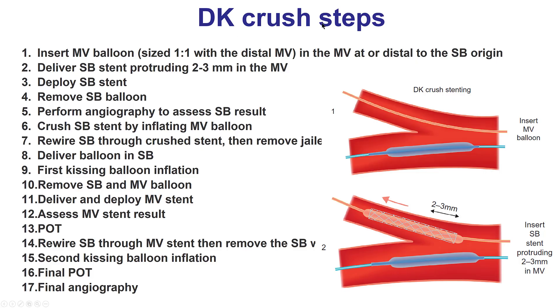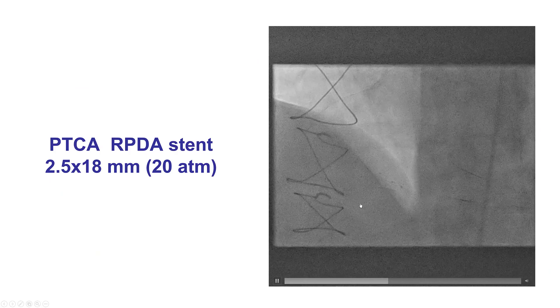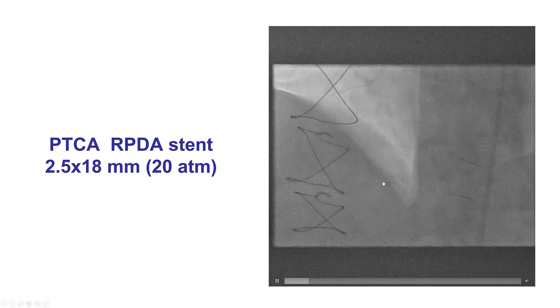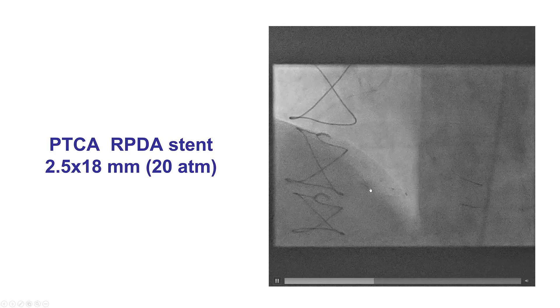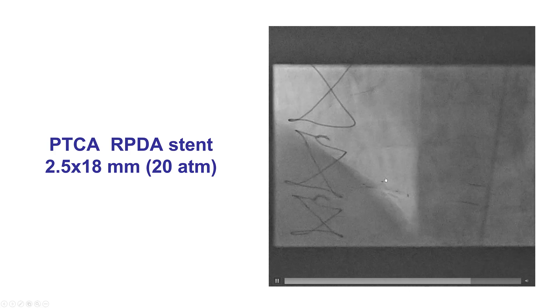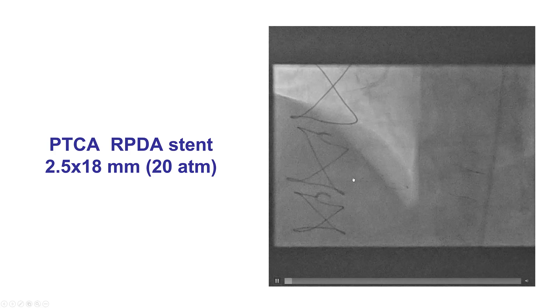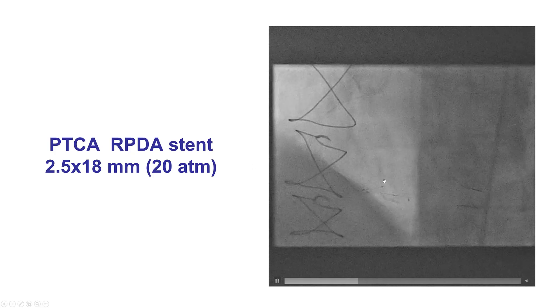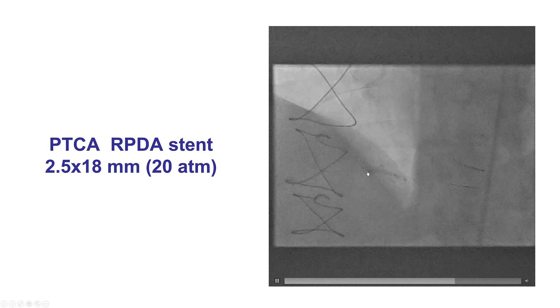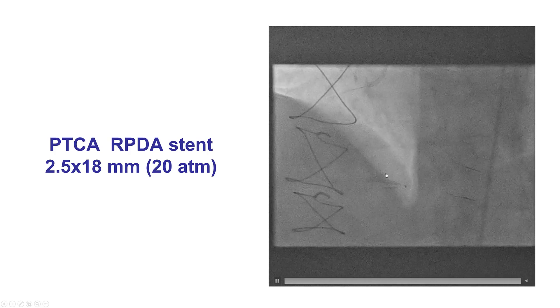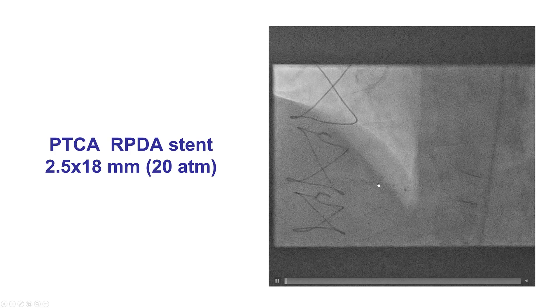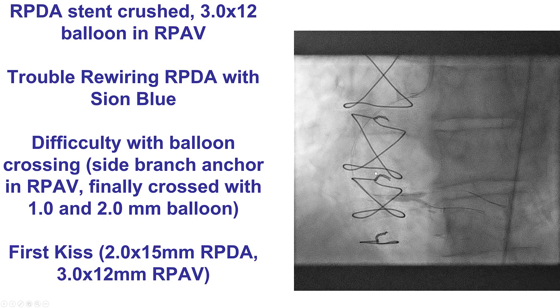We have the 17 steps of DK Crush, starting with ballooning, delivering the side branch stent, then deploying the side branch stent and removing the side branch balloon. Before crossing the stent placed in the side branch, it is important to confirm that the stent is adequately expanded. So we took a 2.5 mm NC balloon and post-dilated the stent to ensure optimal expansion. We still have the balloon in the main vessel to be able to crush the stent once we achieve an optimal result.